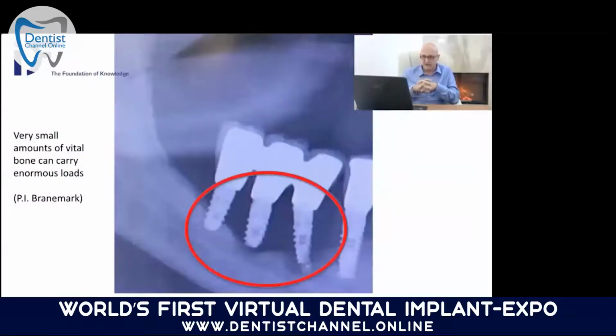But what this picture tells us is that these large surfaces are not necessary at all, because look at this implant. It is almost not connected to the bone. The bone in the old times was up here. This implant is not connected to the bone at all. Only this implant is connected to the bone in the apex area. So in this lower part of the implant, let's say 1/10 or 1/15 of the surface, it is now osseointegrated. These implants are not osseointegrated at all.